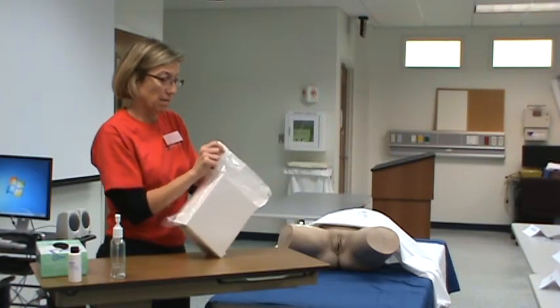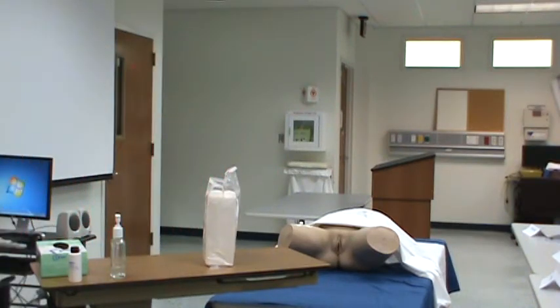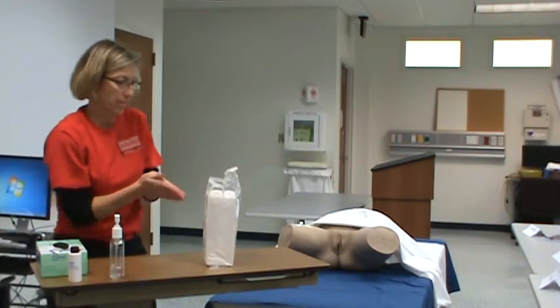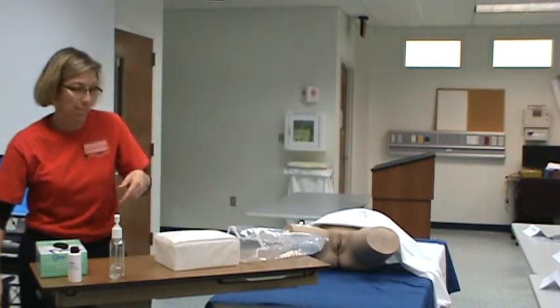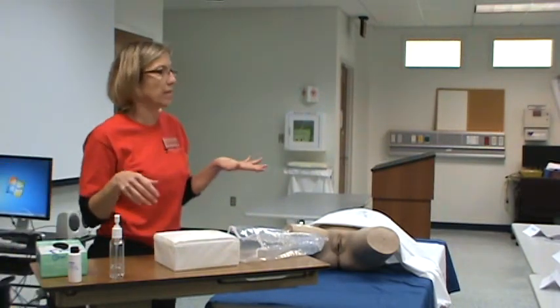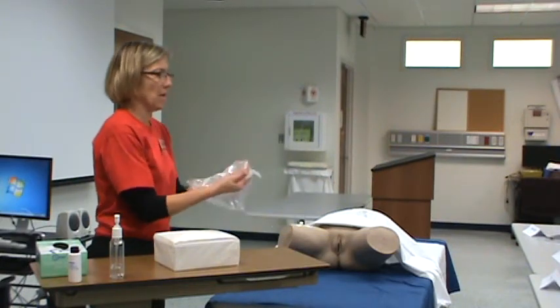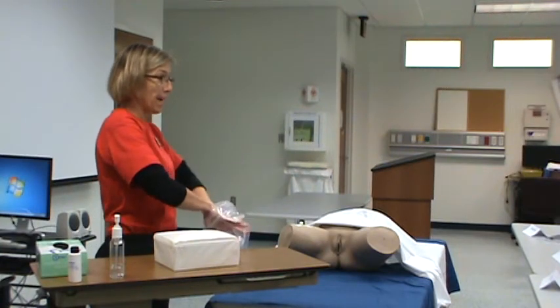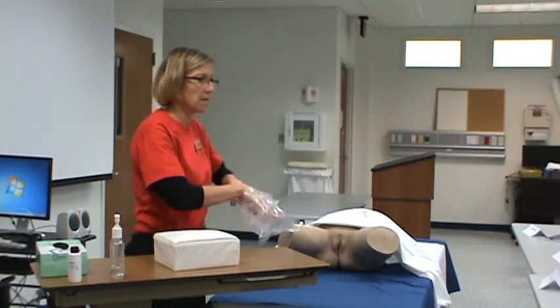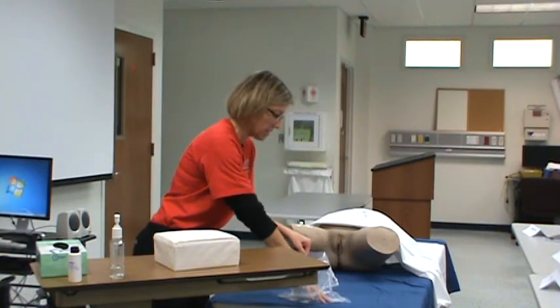So this one has an opening at the edge, like so. And I'm going to move my trash can over here and do a little more hand hygiene. Now, the way I do it and the way it's demoed here, there are similarities and there are also some differences. Today, I'm going to utilize this as a nice little trash can. There are drawbacks and advantages to using this as an area for a trash can. Can anybody think of an advantage would be what?